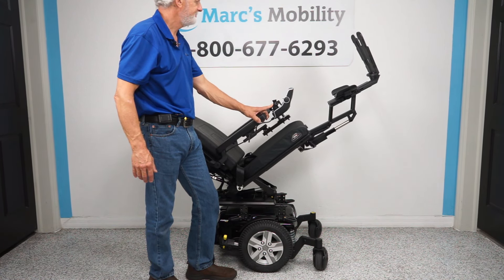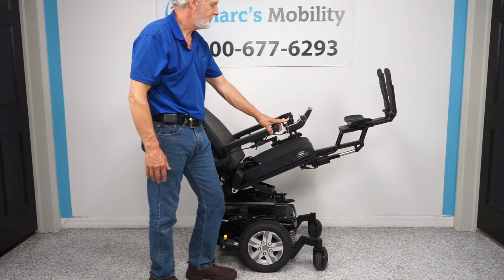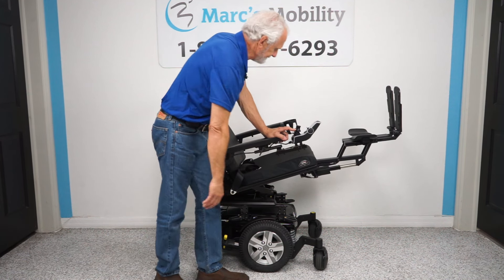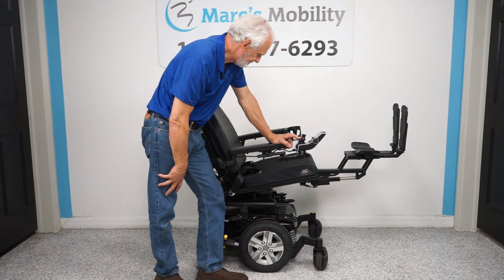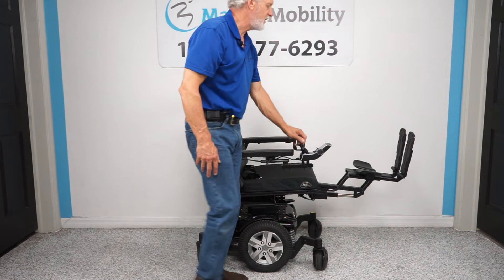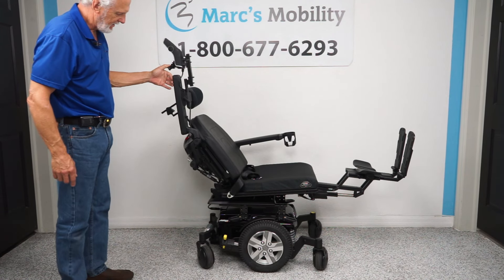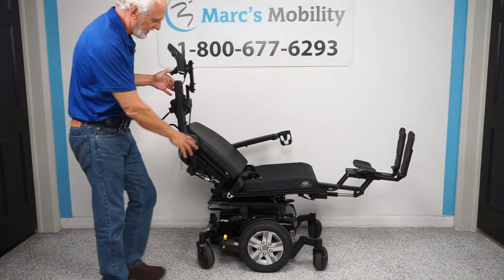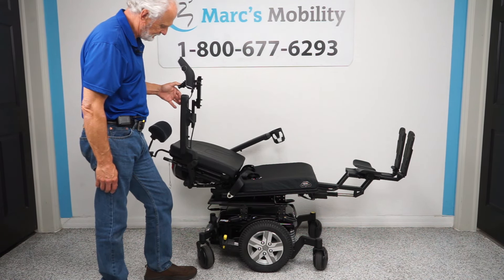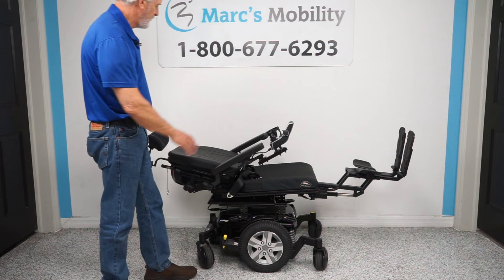Even halfway tilted, your feet are still higher than your body. I'll bring the seat back down to flat. The next thing I'll show you is the recline — that's just the back going back. Watch the back go back by itself; this is called electric recline. This is as far as it will go — that's your position if you're laying flat.